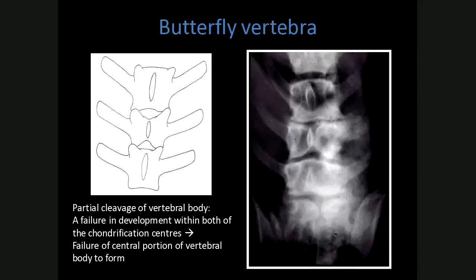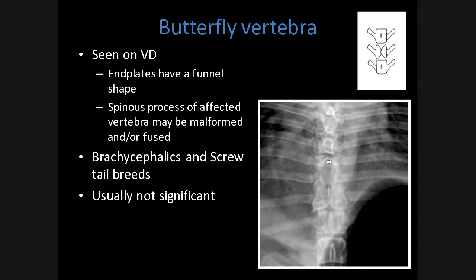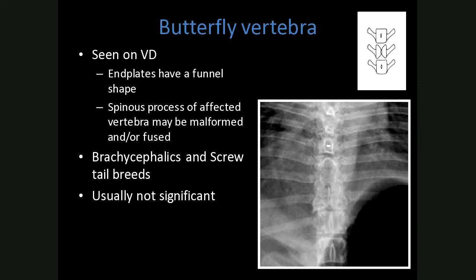Butterfly vertebrae look exactly as the name indicates. They're due to partial cleavage of the vertebral body — a failure in development of both chondrification centers — so the central portion of the vertebral body doesn't form. The butterfly shape is clearly seen in this example. A VD view is needed to see it, as they are difficult to appreciate on lateral views. The end plates have a funnel shape and the spinous processes may also be malformed or fused. Butterfly vertebrae are more common in brachycephalic breeds and are usually not clinically significant.